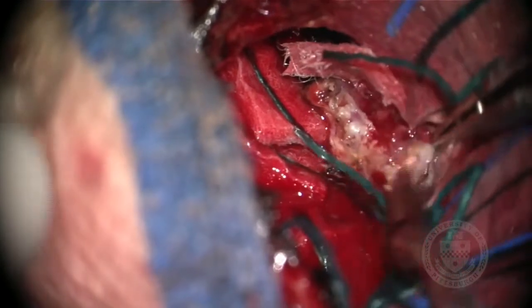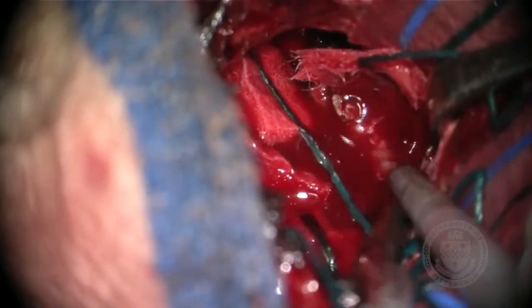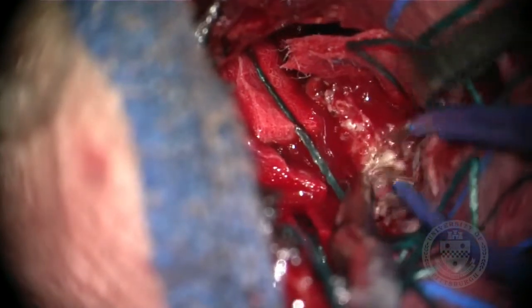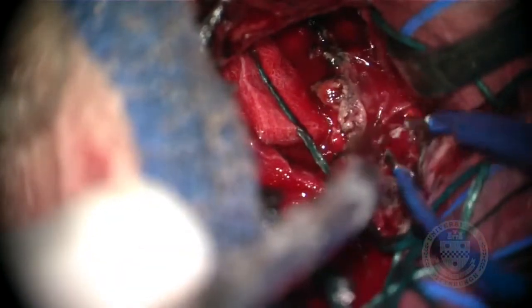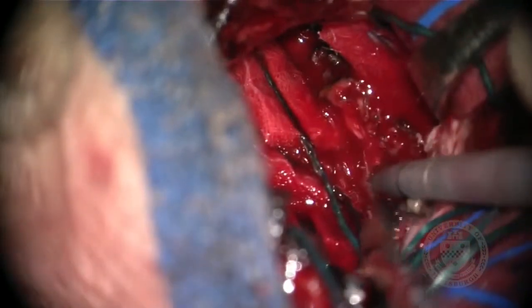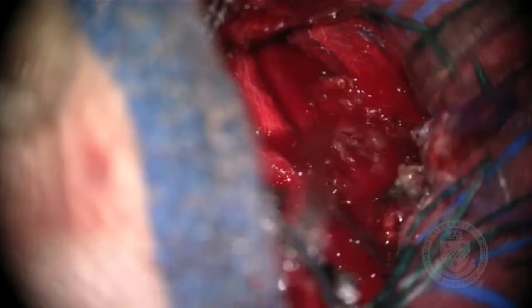Now when we have defined the location of the brainstem, we can continue with debulking of tumor on the hippocampal area. There is significant bleeding from tumor vessels — this is a GBM and therefore a very vascularized tumor. We see again our brainstem interface with the tumor, and our goal is to debulk the tumor all the way until there is only a thin layer of arachnoid left at the level of the brainstem.